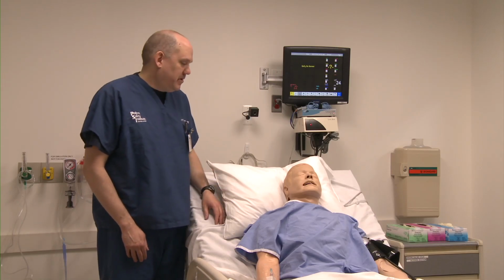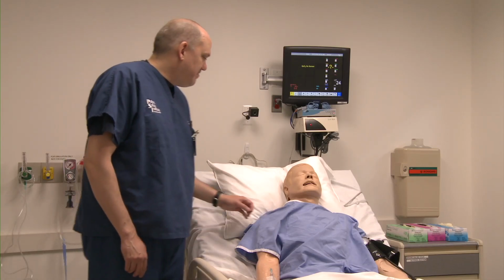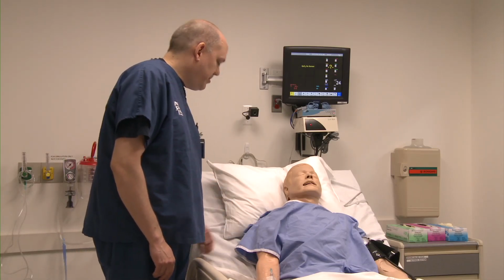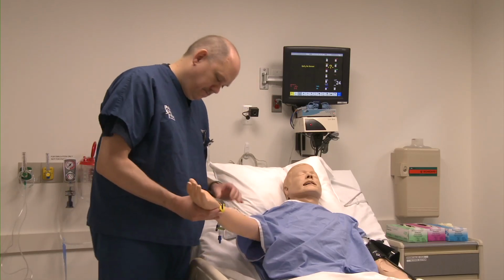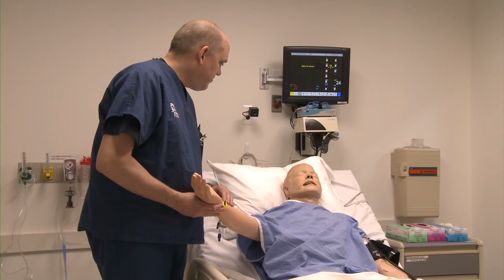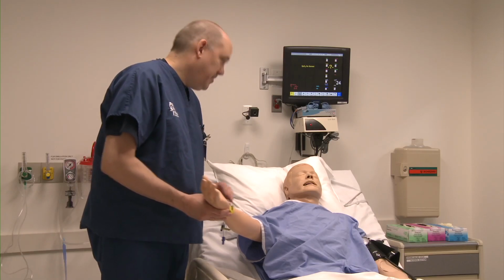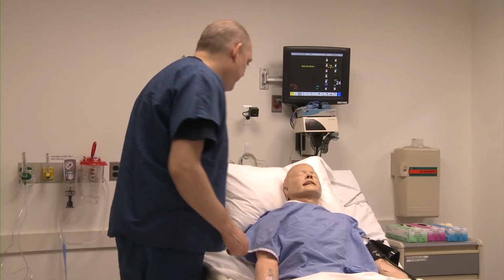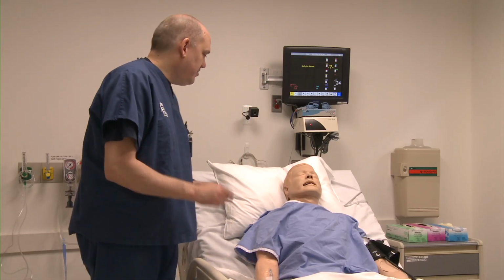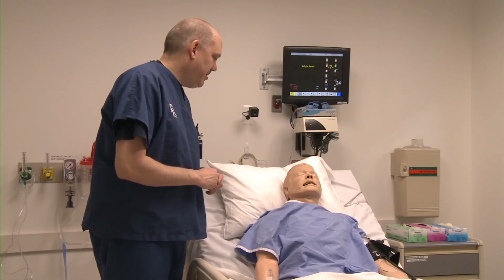All of our simulators are capable of speaking. Hi, my name is Bob. I'll be your nurse today. What is your name? My name is Thomas Moore. And your date of birth, Mr. Moore? May 5th, 1952. That's fantastic. I think you'll find that many people will ask you your name and date of birth so that they are certain they are taking care of the correct patient.